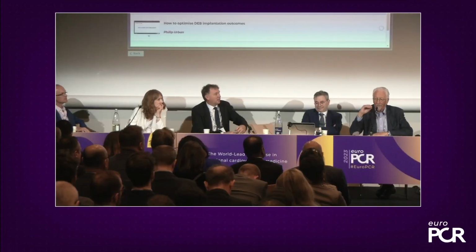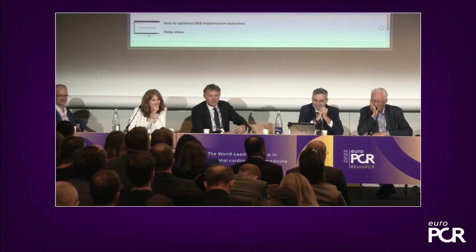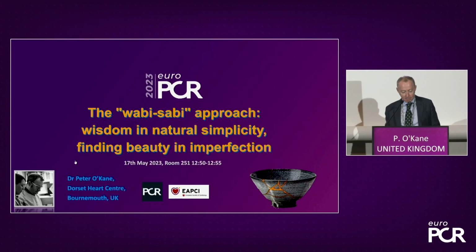I'll put you out of your misery then. So what do we do? I think Antoinette's comments are really well made, and I think you're absolutely right. The calcium burden here I didn't think was too severe. So our strategy is not to go up front with any form of device that's expensive, and we're going to just do as you suggested.